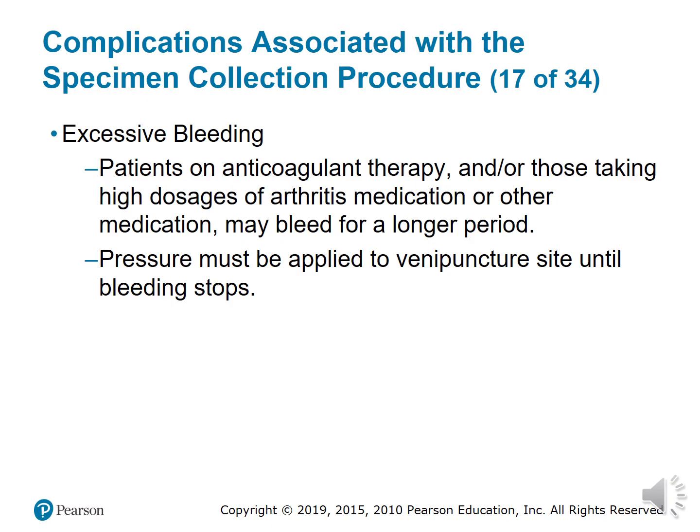And it also helps them not to have a hematoma, because the last thing we want is for a patient, especially an outpatient, to get up from the chair and all of a sudden their good shirt is ruined because blood has seeped through from the venipuncture site. And sometimes you can stop the blood flow and it's not flowing, and as soon as they move, it starts up again. So there's some things we can't prevent, but there's some things we can, and that's one of them, to make sure that they have completely, utterly stopped bleeding, especially if they are on blood thinners.